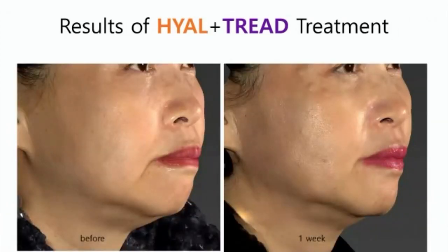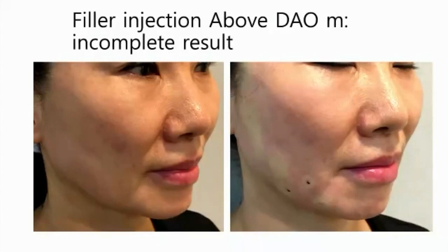Magnified view before and after, 1 month later. The jawline is lifted up a little bit, and the depth of the marionette line is shallower than before. But with the filler injection, sometimes we inject above the DAO muscles. At that time, the result is not completely satisfactory, because superficial injection of the filler above the DAO muscles sometimes leaves the lines remaining.